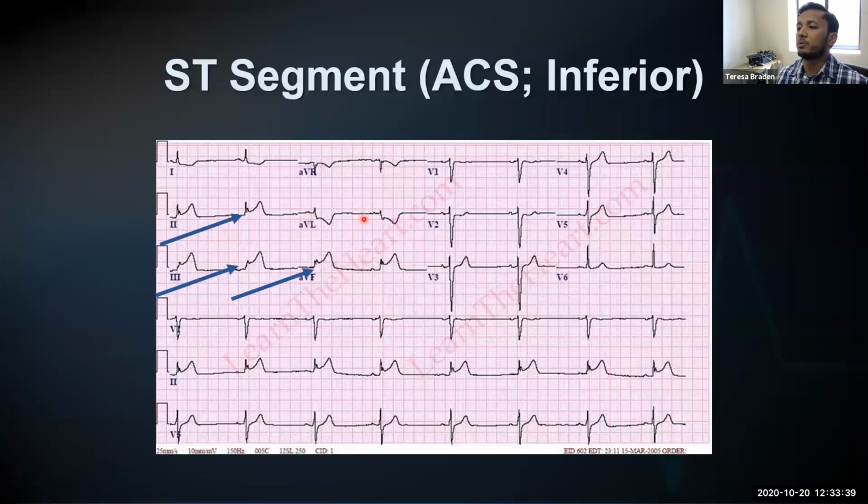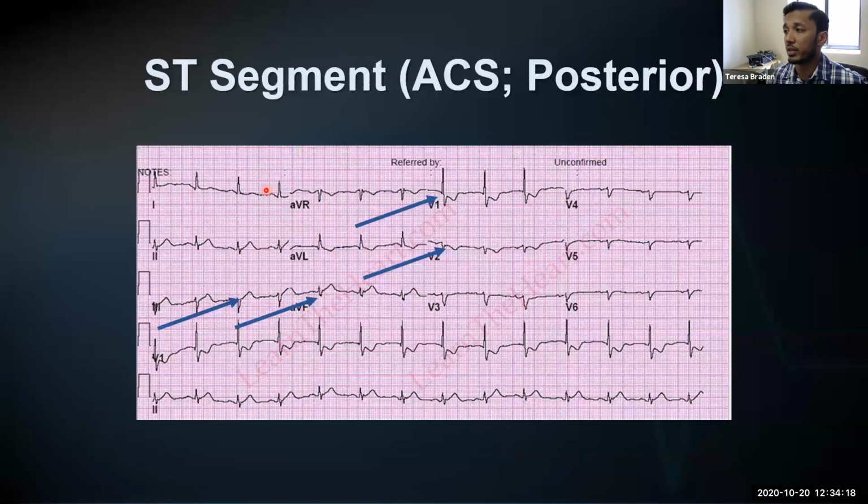And an inferior infarct, we just talked about that ad nauseum with right ventricular infarcts as well as our posterior infarcts. Here in 2-3 AVF, we can see some elevations going on. If you wanted to look for a specific right ventricular infarct, what pattern would we look at between leads 2 and 3? Exactly, Dr. Chaudhry. So greater elevation in the ST segment in lead 3 than 2. And then we look for ST depressions. Here I can see one in AVL and even in lead 1, which we know pair up as the high lateral. So it makes sense that it's consistent with that inferior infarct.